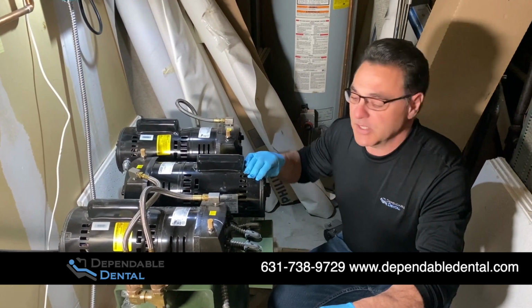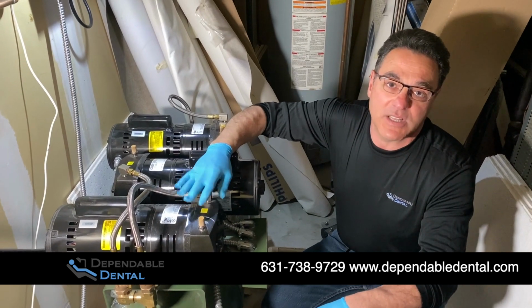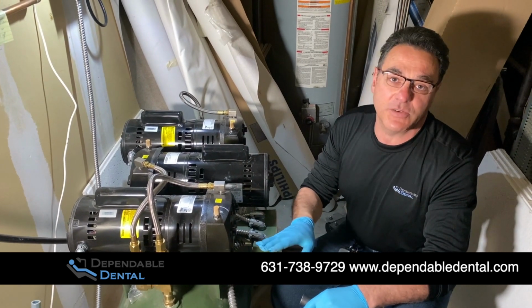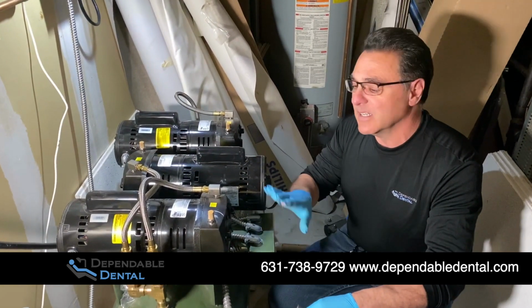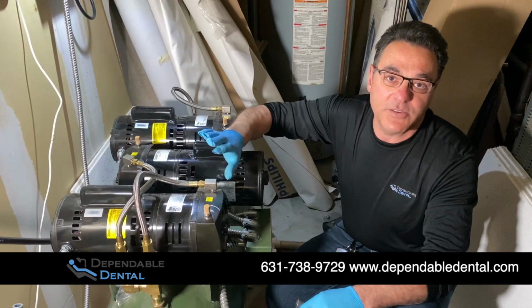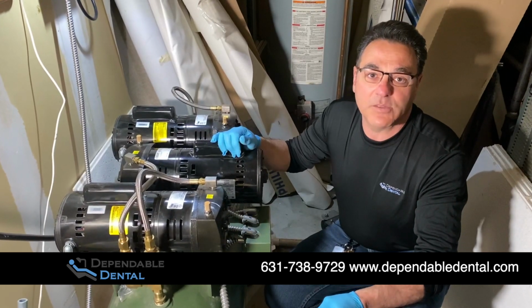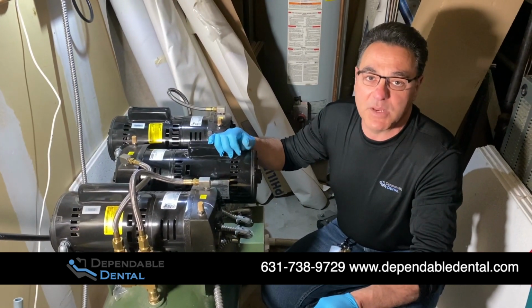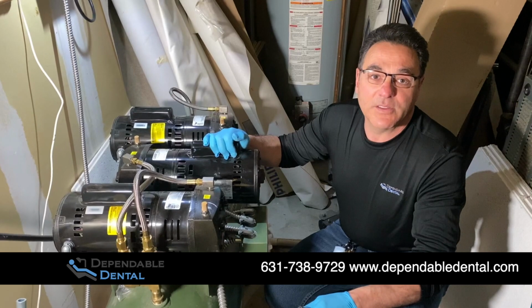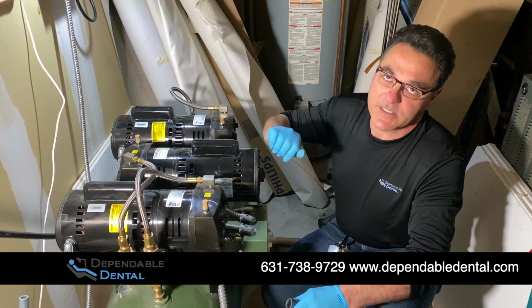This unit is no longer in production, but what is common to it is the GAST manufacturing head. These heads have been used in many different manufacturers' surgical suction units. Going back to Matrix and McKesson, they use the GAST heads. Some of them used to have the oil dispenser in them. These are dry units, no oil in them. DCI produced them for a while, and now the best and only place to get them is Midmark. Midmark has the PM, the Power Max series, and that's the 1, the 3, and the 4. Those are based on users. The 1 has 1 head, the 3 has 2 heads, and the 4 has 3 heads.